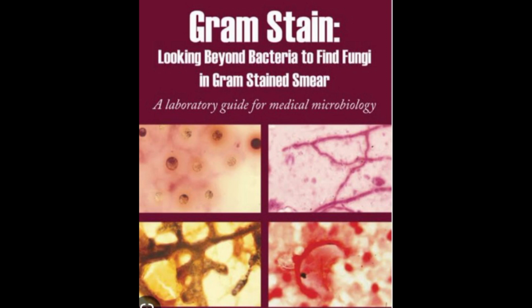Collect the nasal swab, inserting the sterile cotton swab gently through the nostril to the nasopharynx, swabbing the anterior nares with a sterile cotton swab. Collect the wound swab specimen, swabbing the wound site gently with a sterile cotton swab. Collect the material from the posterior fornix of the vagina, swabbing that area with a sterile cotton swab. Collect the male urethral discharge with a sterile cotton swab.